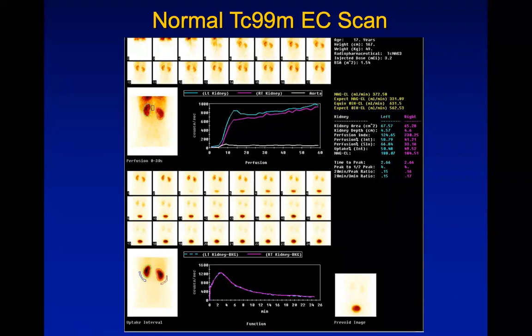In earlier times when we didn't have imaging, only two probes would be put behind the kidneys and all you would have is this curve showing the radioactive counts rising and falling in each kidney. There were no images formed. Now we have the images and we also have the renogram curve. So you can see both curves are practically symmetrical, one on top of the other.